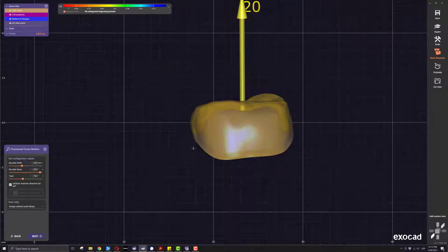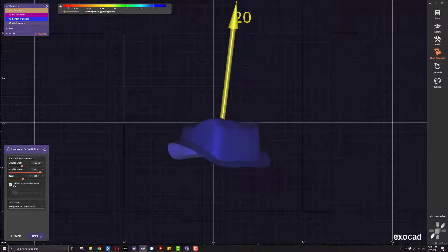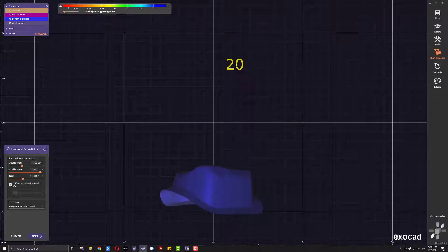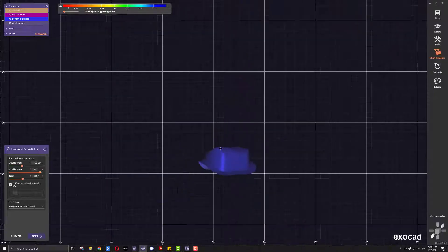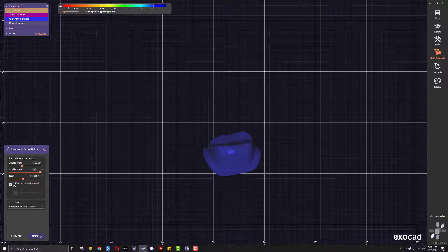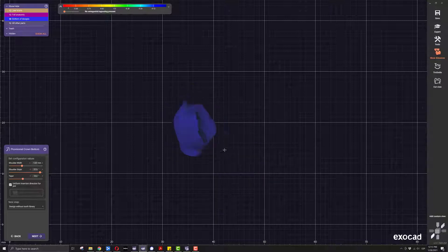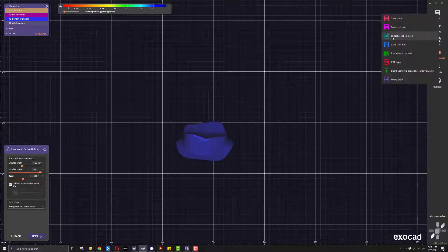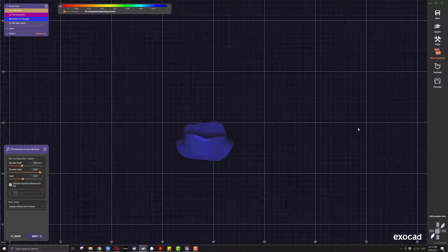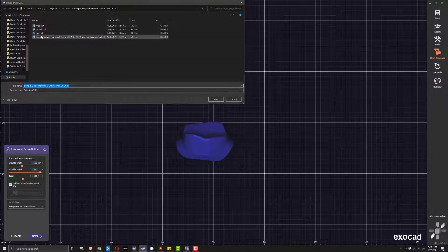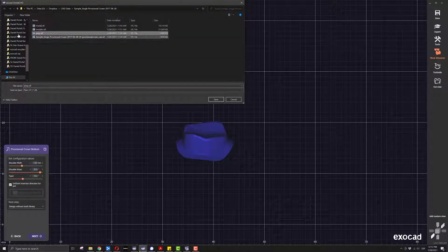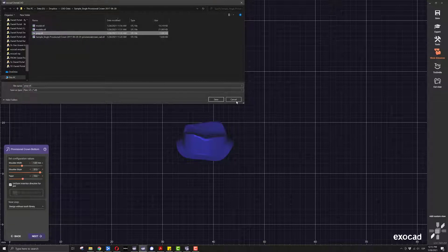Once we have it, what we want to do is hide everything else that's here, and then we are going to save this as an STL. We just right-click — make sure that's the only thing you are visualizing — right-click on the save button and select export to mesh. I have already done this previously, so I created a file called 'prep' and that's all we need.